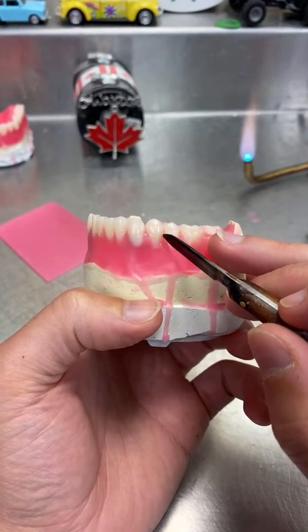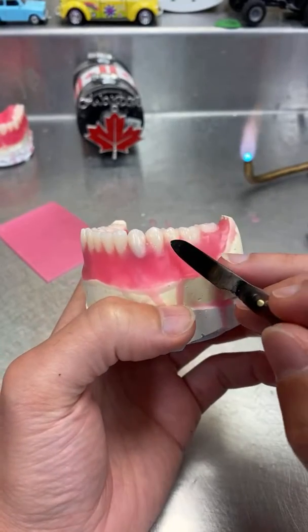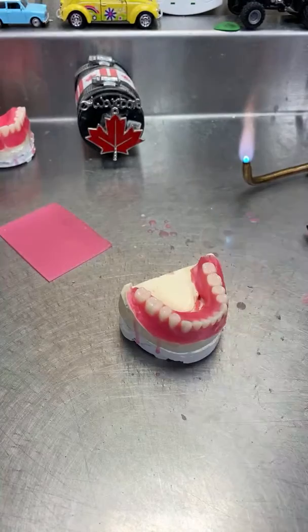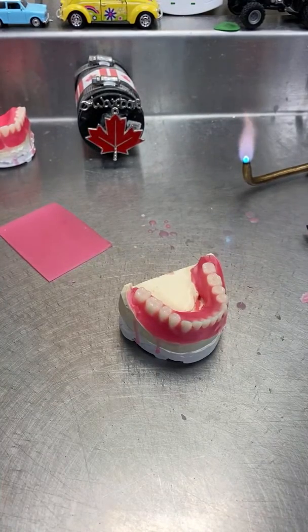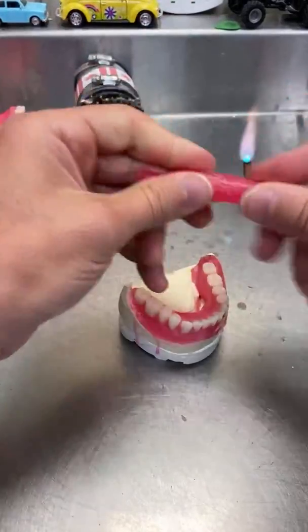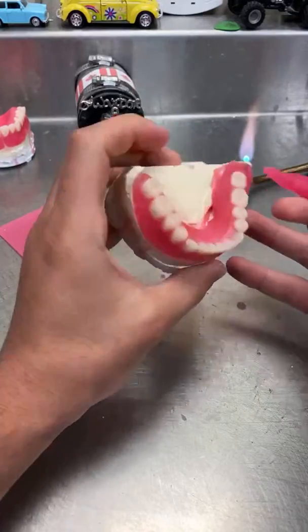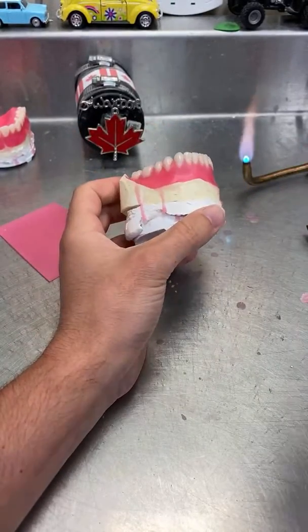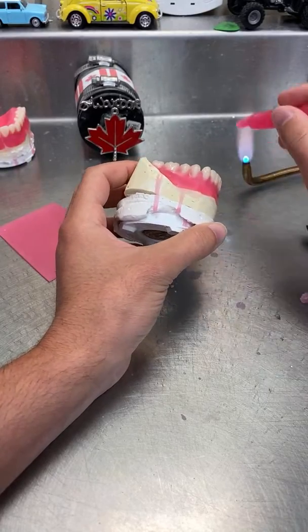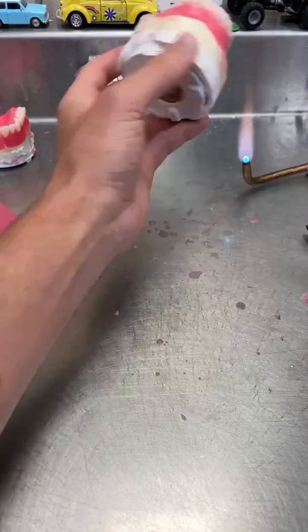You need to actually cover the teeth to here, even if it looks like it's good and waxed up. You need to kind of put more on these teeth. So my favorite way of doing it is, maybe a lot of you would know by now, it's called the wax sausage. So what I'm doing here is I'll add more wax just on these teeth. Gotta make sure everything is warm. Don't want to work on a cold surface.